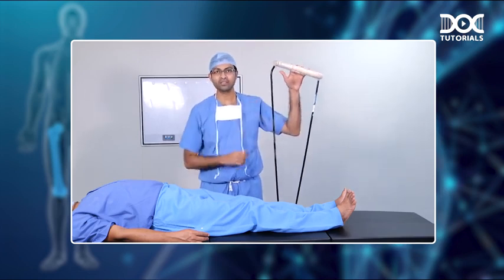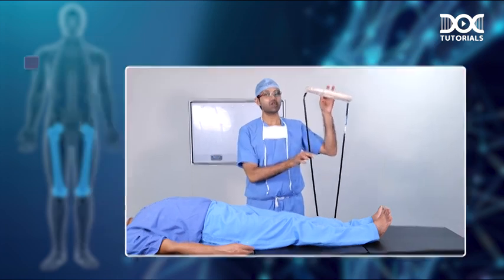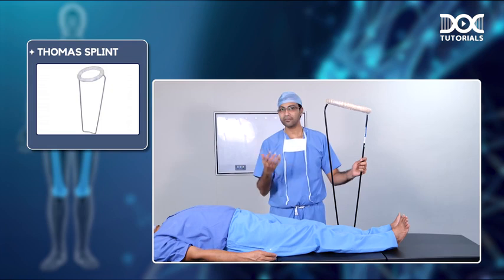Now, can you tell me what device is this? This is a very important spotter for your exam, right? So what is this? This is the Thomas splint. Thomas splint is one of the greatest splints that has ever been designed.